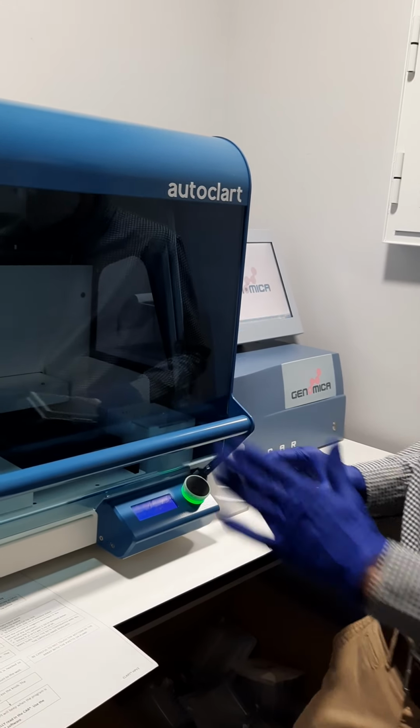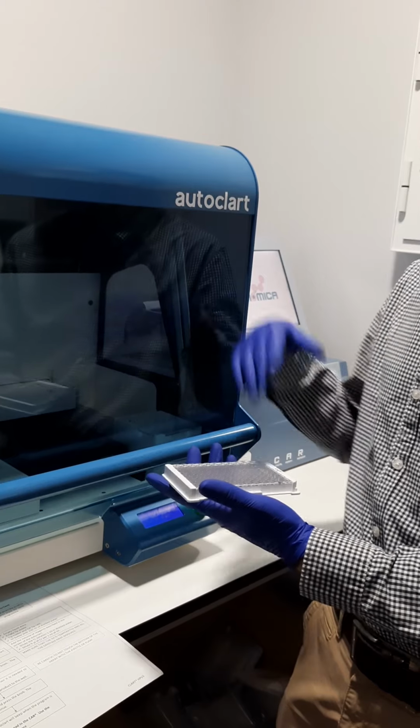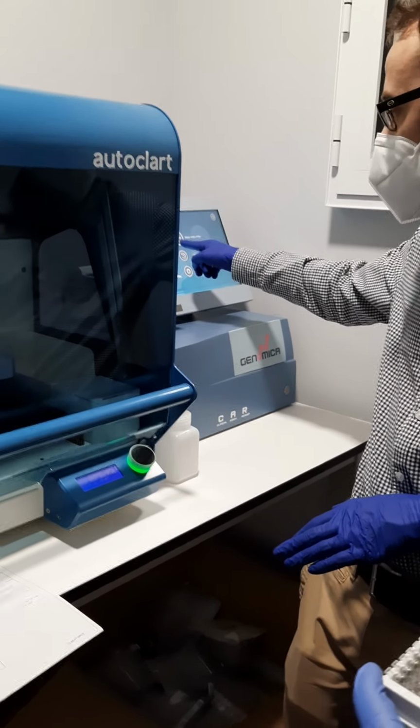Yes, and we have to read it when it's finished. It's a colorimetric assay, so we have to read it. We cannot leave it to read tomorrow, for example. It's a matter of replacing them all. New analysis.